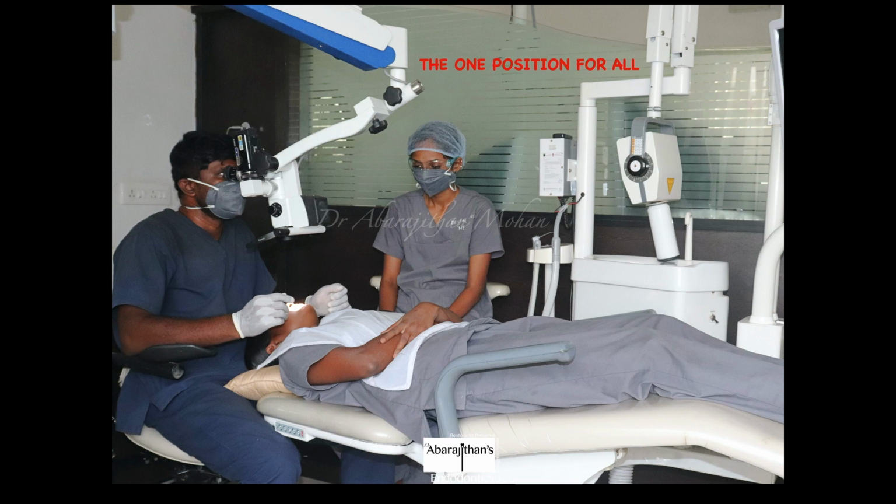So unlike in basic ergonomics where the operator moves his positions according to the clock positions, here the only position that the operator works is at 12 o'clock, and at times, yes, especially for beginners, you can go a little closer towards 11 o'clock position at times for better hand-eye coordination. But as you gain experience, you realize that you always sit and work with the 12 o'clock position. So these are not hard and fast rules, but this positioning is recommended by most of the textbooks and most of the leading authors, because this is one of the most ergonomic positions to perform all the procedures.